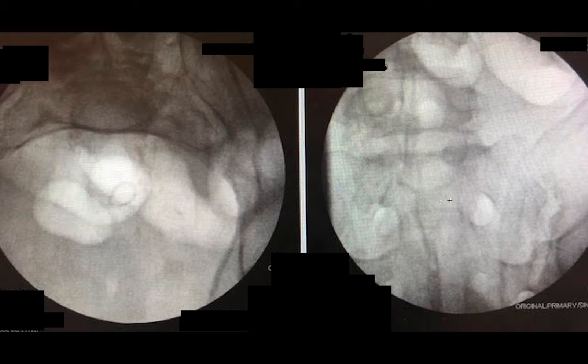So you need to have your symphysis and your ramus over the S2 body, which, this is the right-sided ramus, and that is technically in the correct position. That is where it's supposed to be. This one is further down, but here are the foramina right here, and this is kind of right below them. So this is reasonable, and you can see the SI joint kind of gapped open here.